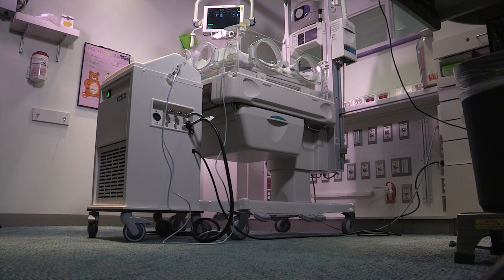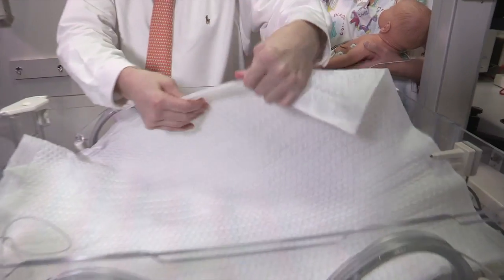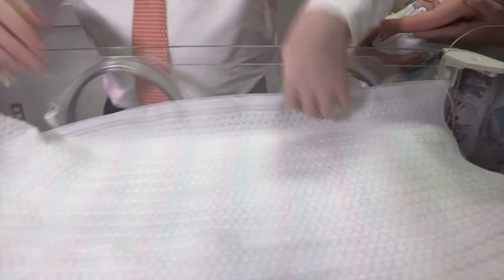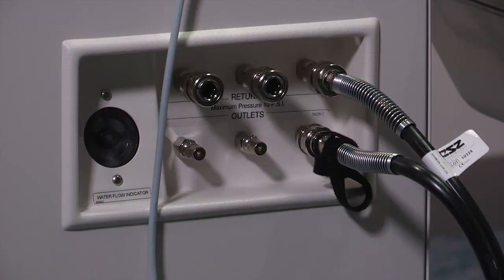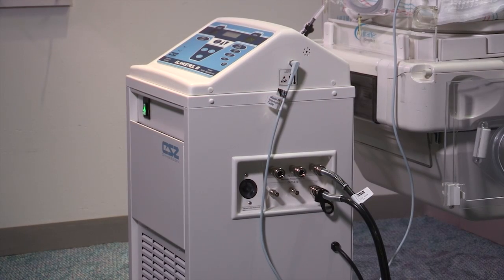This is the setup that we have for a baby that potentially is going to be cooled. You can see this is a typical bed that we put full-term babies on who are sick. But for babies who need cooling, before they come, we put this very thin blanket — it's a cooling blanket and it circulates cold water through it, from this machine that we turn the temperature down to about 90 to 91 degrees.